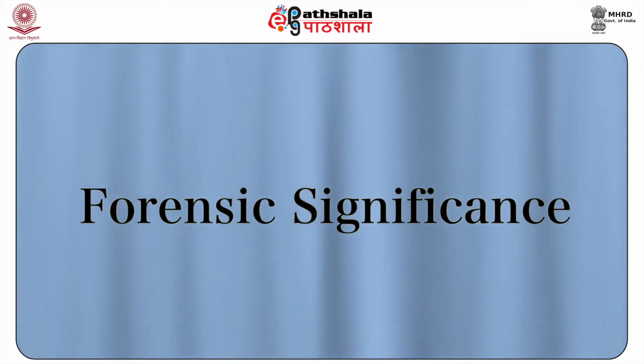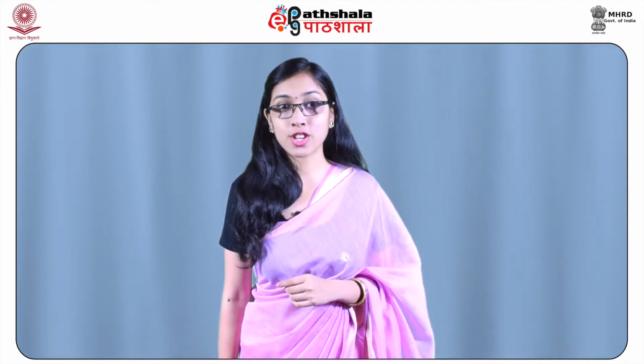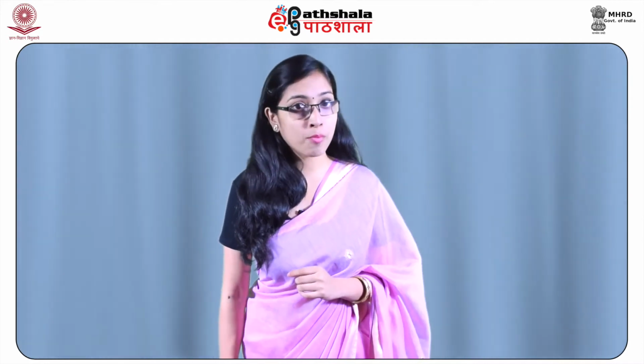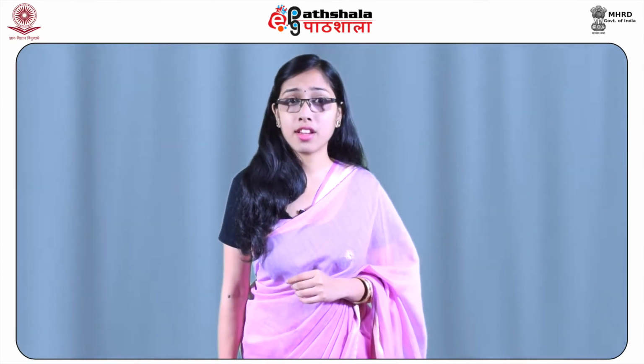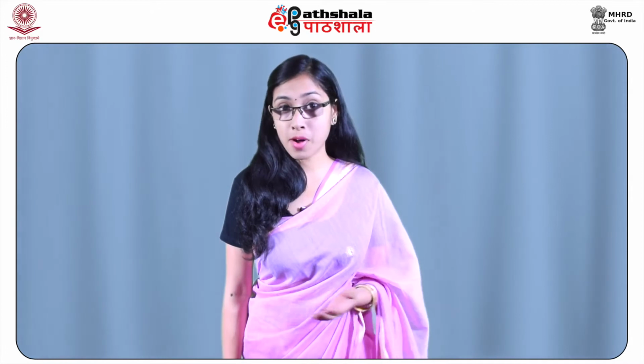Now let us study the forensic significance. A challenging example from the field of forensic toxicology would be the objectiveless search for a general unknown poison in a putrefied tissue sample from a homicide case, or as the case may be. In such cases, a non-selective extraction procedure covering a wide variety of possible target compounds would be required.